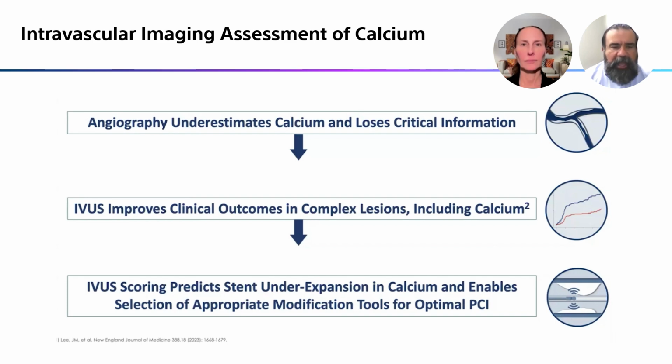The score becomes your habit. So do I stop and measure the calcium every time and make sure it's at least 5 millimeters? I do not, because after doing a lot of these, you realize what needs to be done. So again, I think this slide summarizes the philosophy of CHIP and calcium management in 2025. This is what the goal should be.